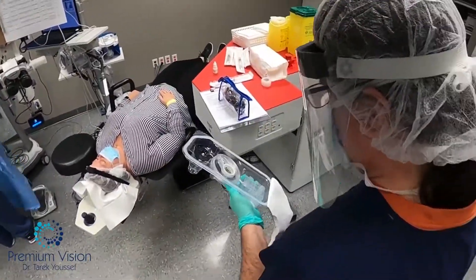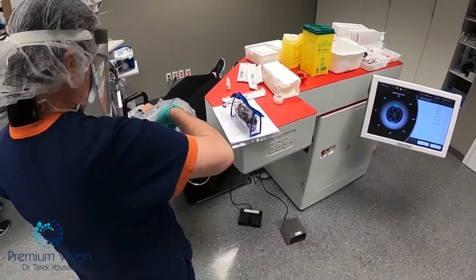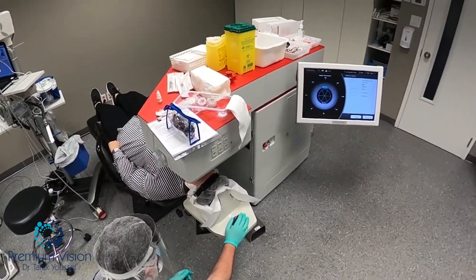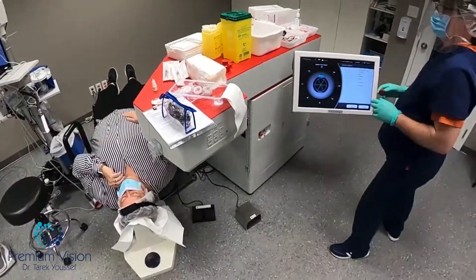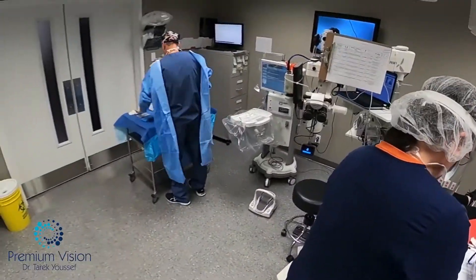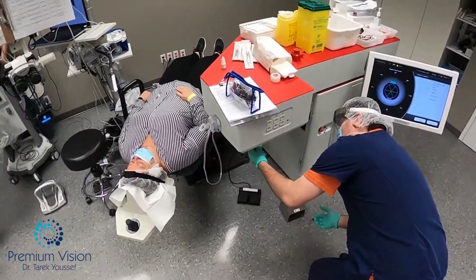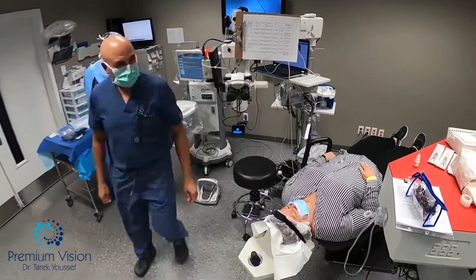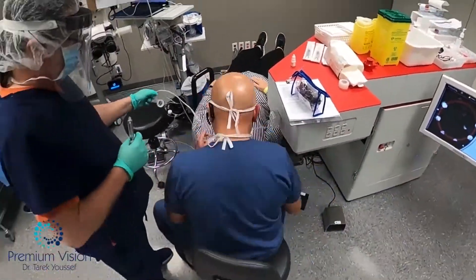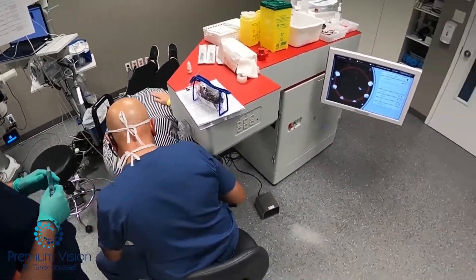I've put it at five times speed to save you time. My technician is inserting the tubing for the laser to insert the LOI, adjusting the patient's level to save time when we start the suction ring. When you make sure you're at the correct level, you save time when the LOI is on the patient side. We reviewed the plan and started the machine to activate it, dry the skin, and inserted the LOI.